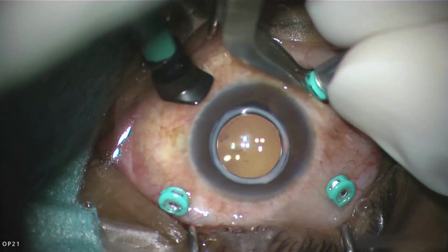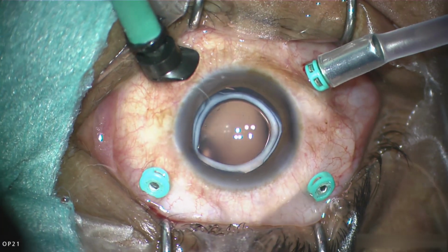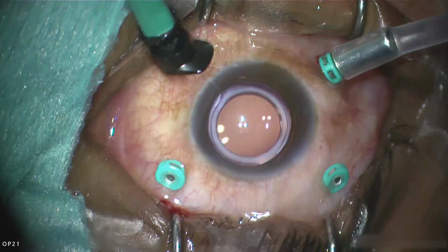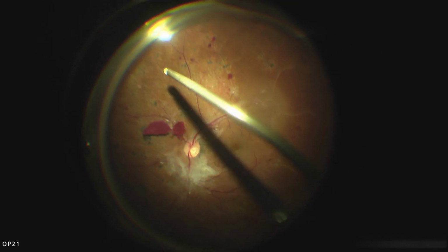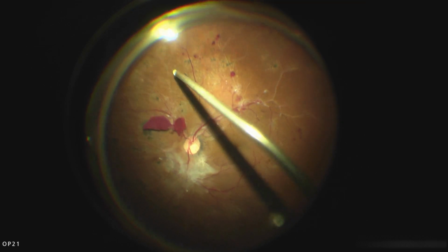This is a case of a patient with proliferative diabetic retinopathy who has had recurrent hemorrhages, has blood proliferations, and is not really caring for their blood sugar levels properly. So that's an indication for a vitrectomy.